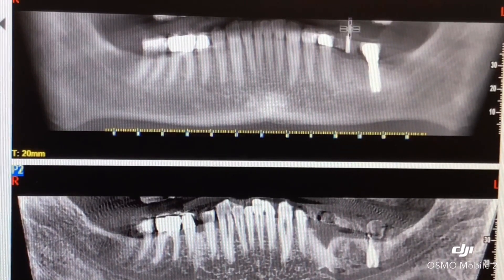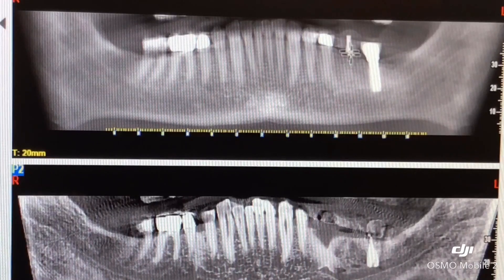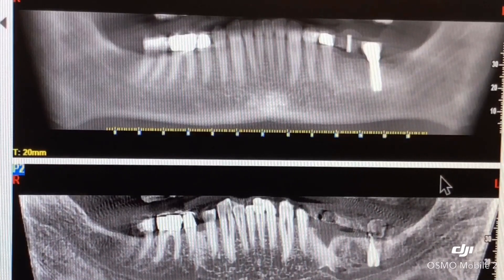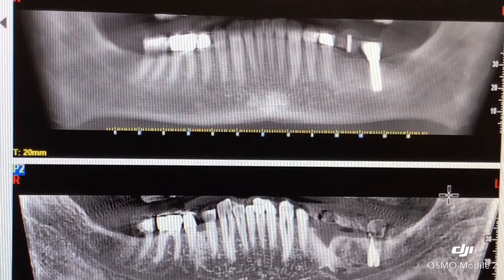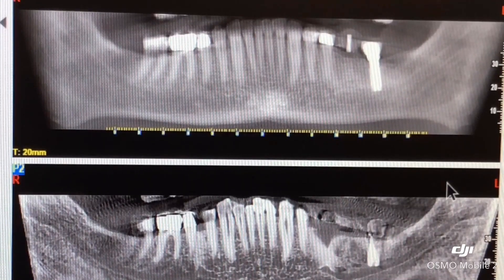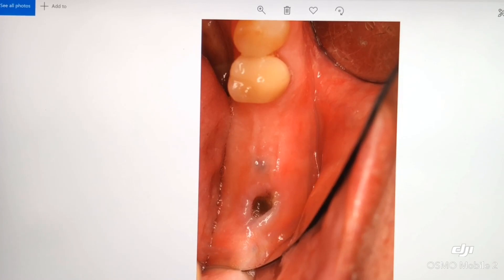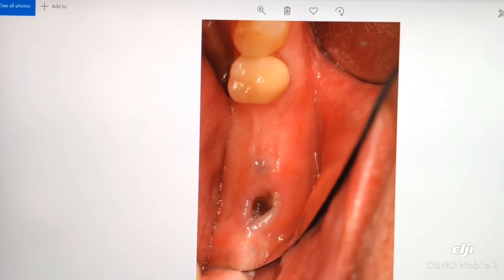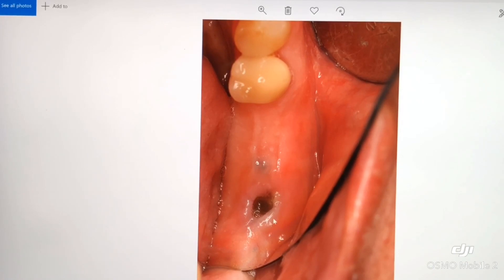This is a small gutta percha aperture marker on my surgical guide, so this isn't a true guided surgery — it's a semi-guided surgery. This is our patient before the surgery. This is the location of the titanium implant, which is a 30-year-old implant.